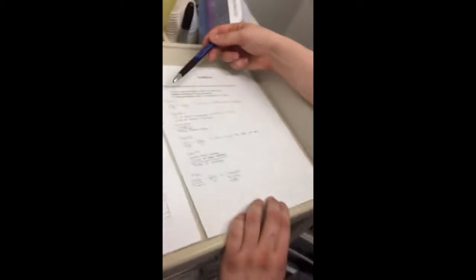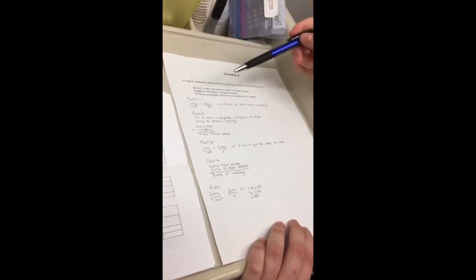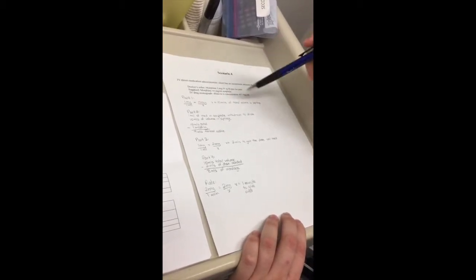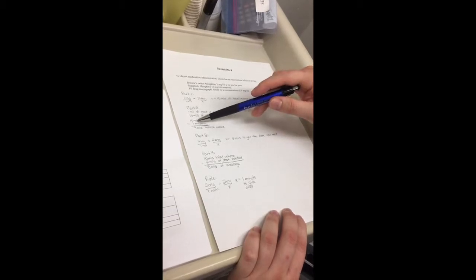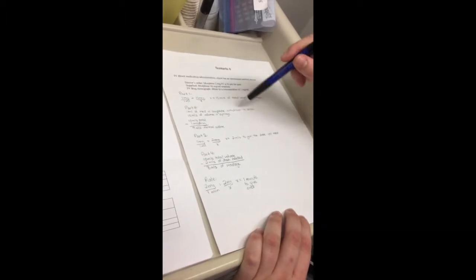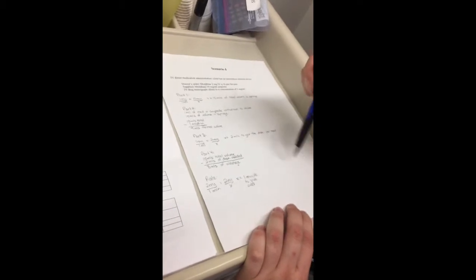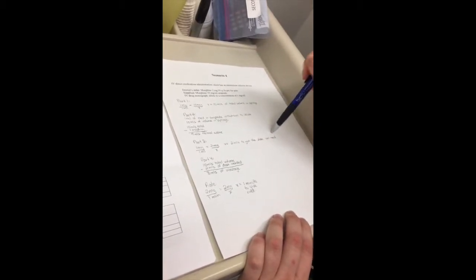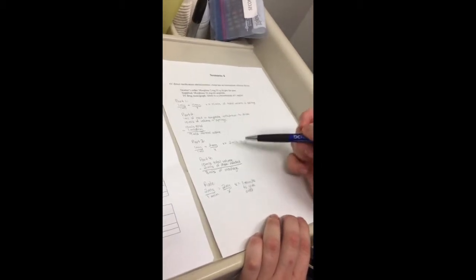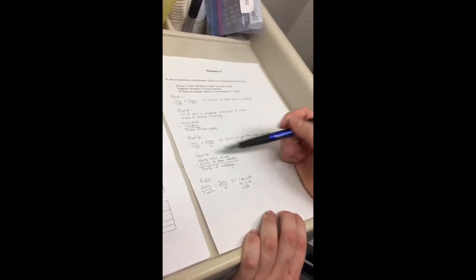I have done my math here. I'm going to want 10 mils of total volume in the syringe, and 1 mil of that volume is going to be the medication, which I've drawn up from the ampule. 10 mil total volume minus the 1 mil means I'm going to be diluting with 9 mils of normal saline. Part 3, figuring out how much is for the 2 milligram dose. To get the 2 milligram dose, I'm going to give 2 mils of this. Then I have to figure out how much I'm going to waste. For the 10 mils total and 2 mils of my dose, I'm going to have 8 mils of wastage.